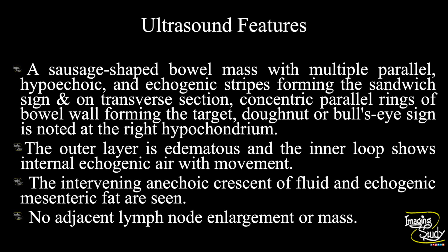The intervening crescent of fluid and mesenteric fat are seen. No definite enlarged lymph node or mass could be located. So the diagnosis is intussusception.